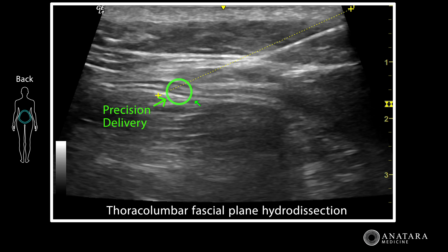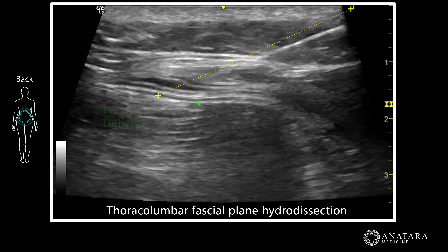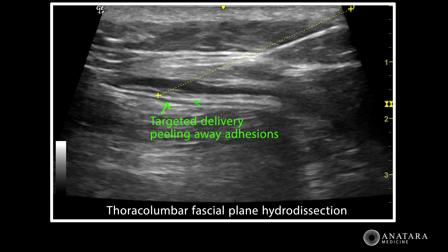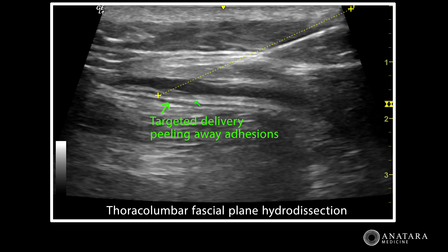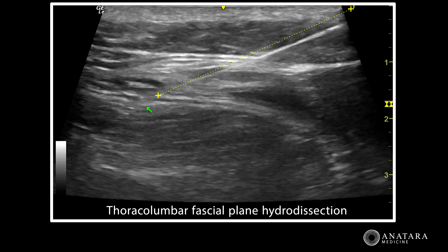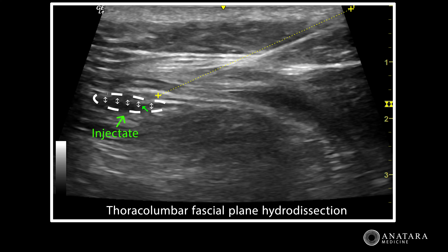You can see that we know exactly where the tip of the needle is with ultrasound, and we are now proceeding to inject regenerative fluid into the area above and below to open up any restrictions and adhesions in that connective tissue plane. We now proceed to inject below the thoracolumbar fascia to also relieve any further adhesions.